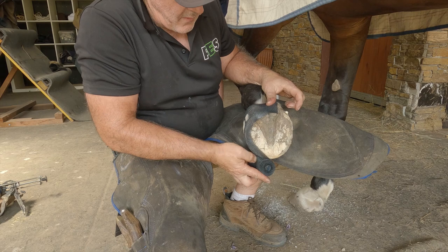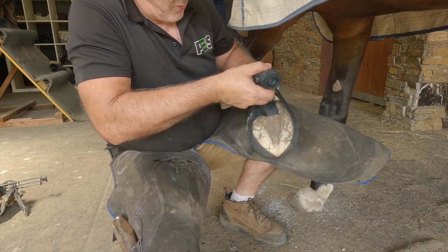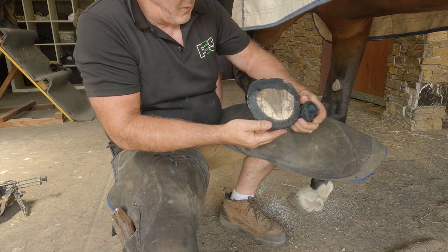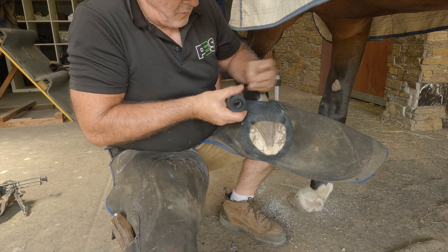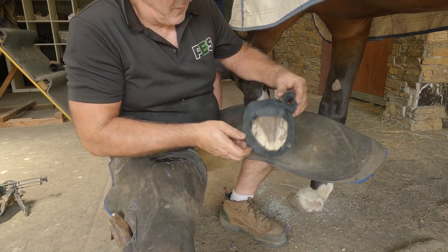I place my cast in a bucket of water for about 10 seconds. Once removed, I squeeze the excess water from it, which also ensures the cast is wet all the way through. Once I begin applying my cast, I go for maximum thickness around the hoof, which is the reason that I don't wrap up and down the hoof wall.